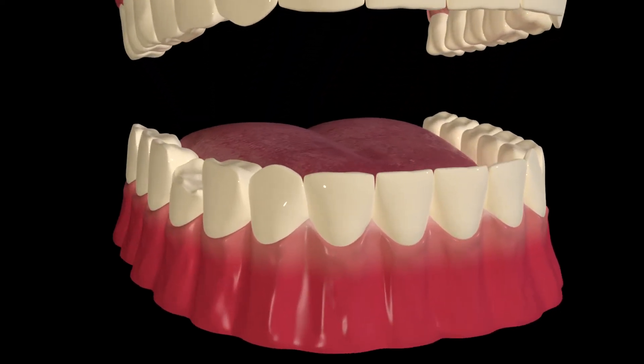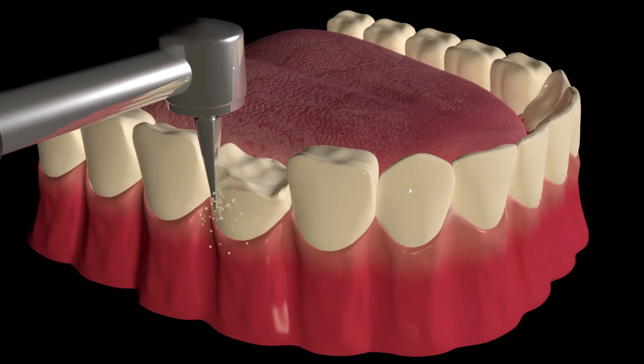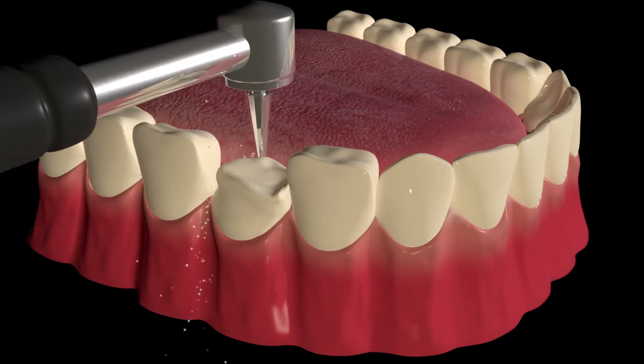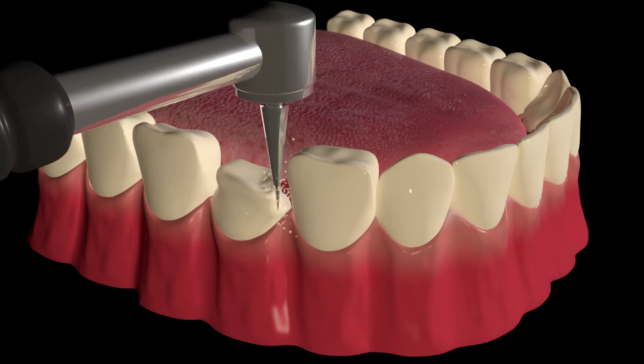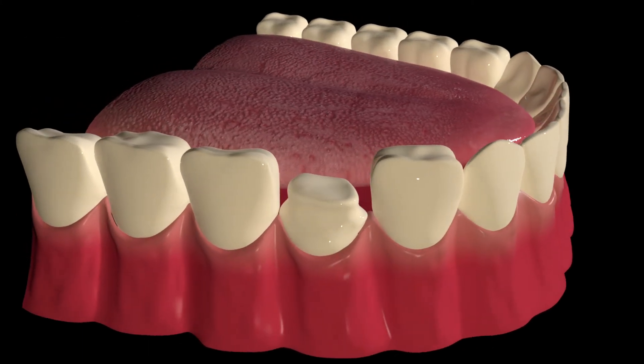Your dentist will wait for you to numb up, and then they will prep the tooth by shaving down the surfaces of the tooth, making the tooth into a smaller version of itself — like a stump shape. You may notice lots of suction and some drilling as they reshape the tooth for it to accept the crown.